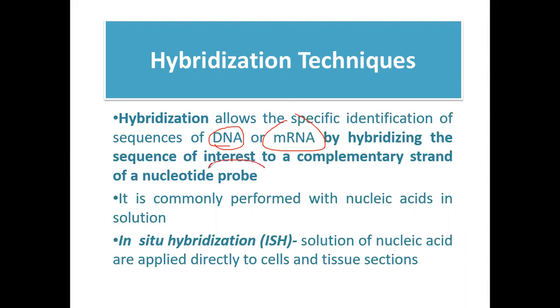So remember earlier, guys, the label or the antibody, right? We use the antibody to detect the antigen. Earlier in immunohistochemistry, we're using the antibody to detect the antigen in the tissue or in the cell. In this technique, we are using a complementary strand of nucleotide. We call this your probe in detecting the unknown nucleotide sequence.